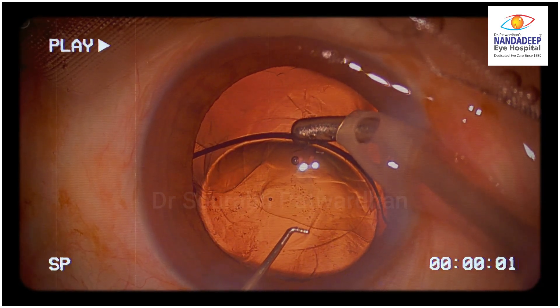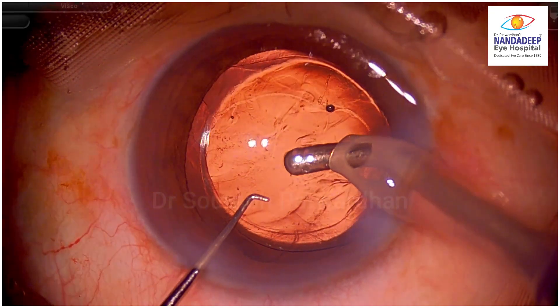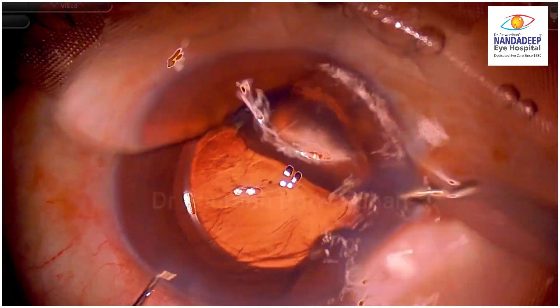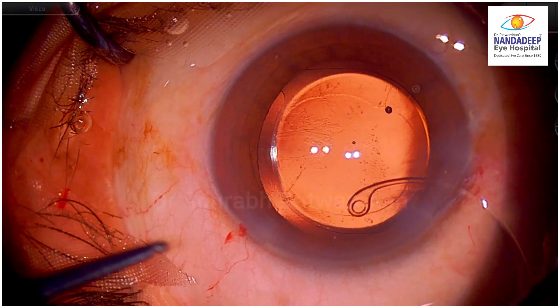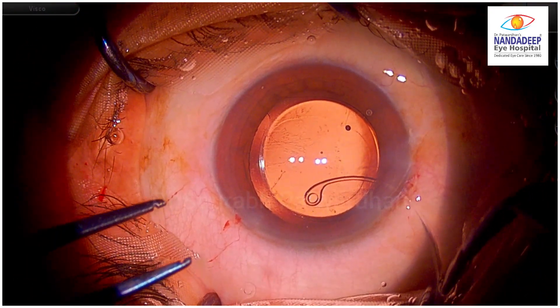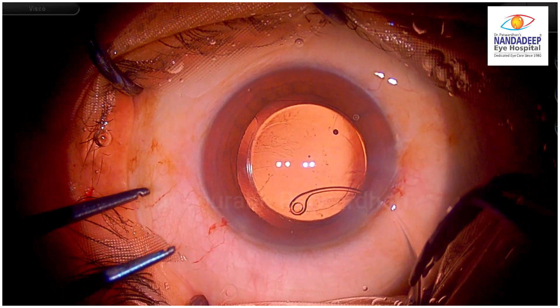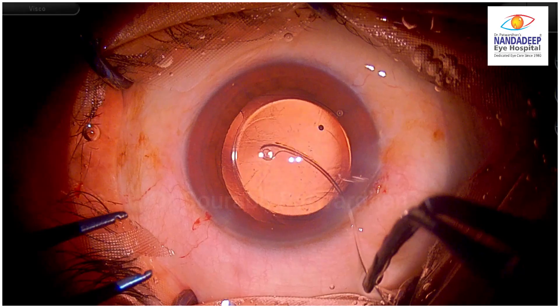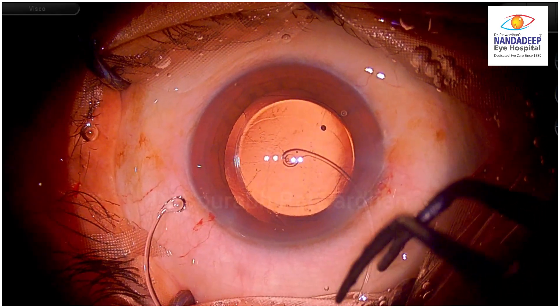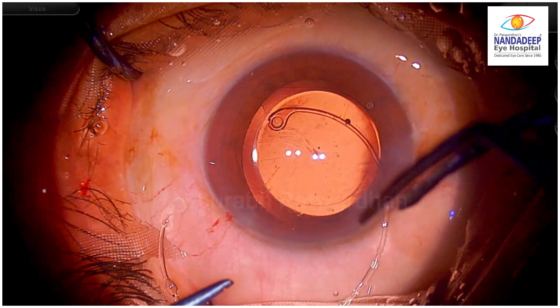So the surgeon decided to put a capsular tension ring to stabilize the bag, though the IOL appears well centered in the bag. For prevention, so that later when capsular fibrosis occurs we don't want any decentration of the IOL. So this is the way the CTR is being injected.